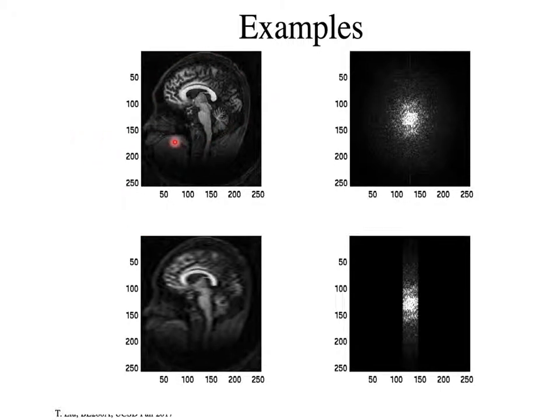So here are some examples of what raw data looks like and what its image looks like. Remember that S of t, each one of these S's is an amplitude and a phase in the Fourier space, and the 2D Fourier transform of that data gives us this thing, which is our Mxy that we had in that equation.